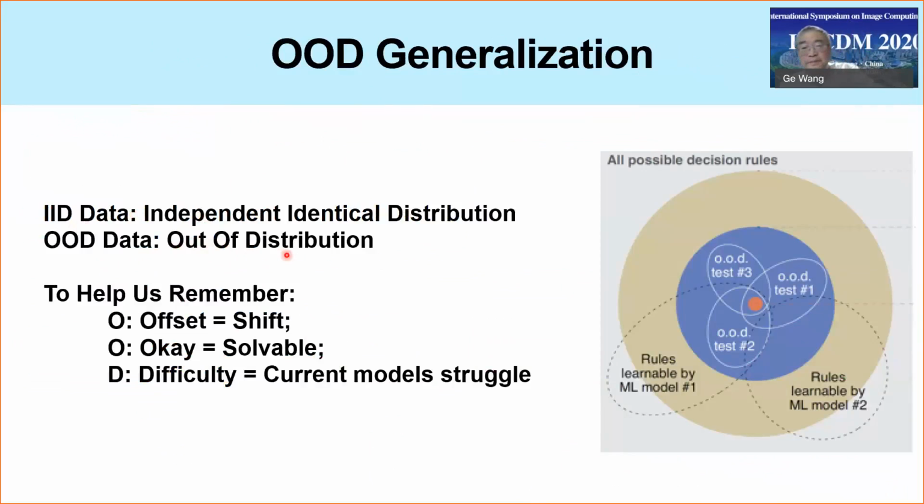To make sure machine learning does what we want the network to do, we can just follow their advice to use a lot of good data, and particularly OOD data sets. So with data sets 1, 2, 3, the intersection will likely be our solution.